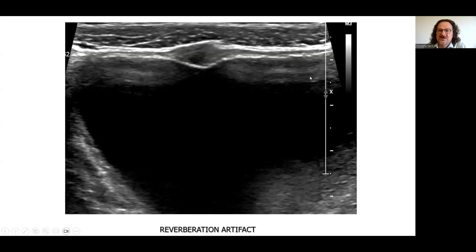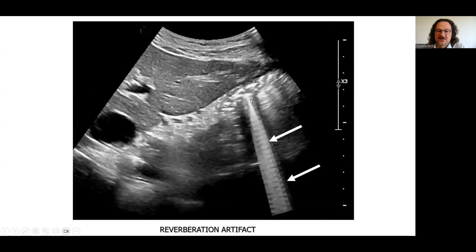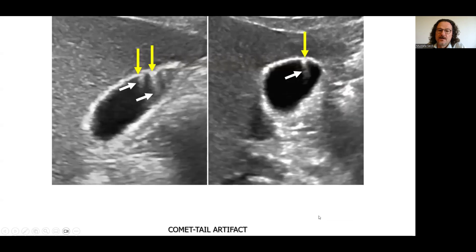This is an example of a reverberation artifact. The strong reflector is the anterior wall of the bladder, producing these reverberation artifacts. This is another reverberation artifact originating from gas inside the duodenum. When the strong reflector is a point, the artifact appears like a comet tail deep to the bright reflector.